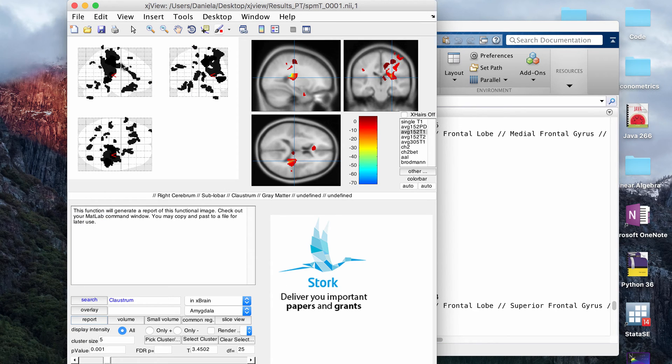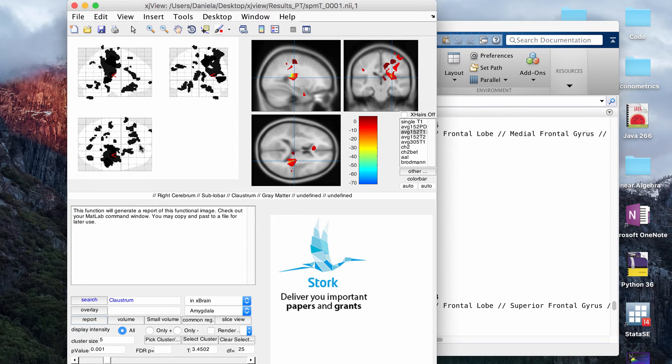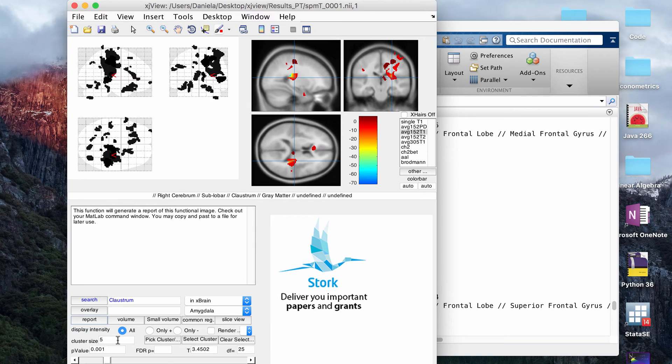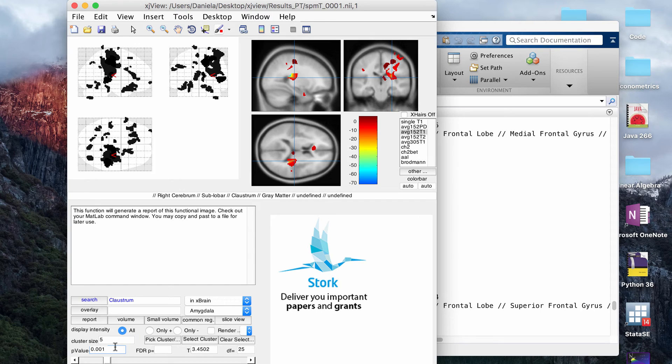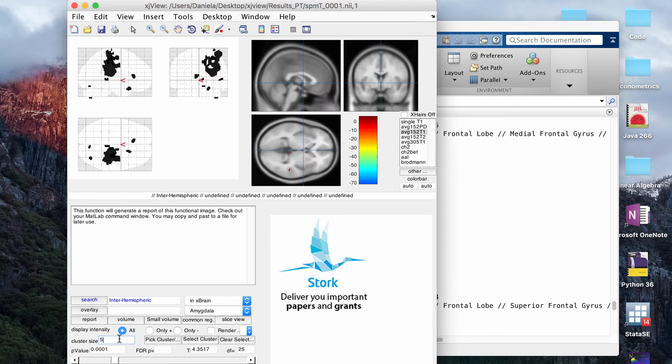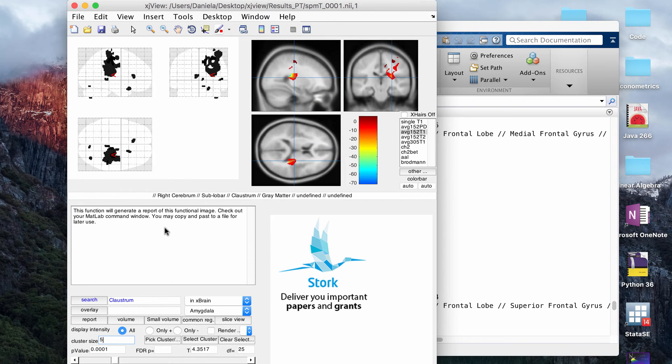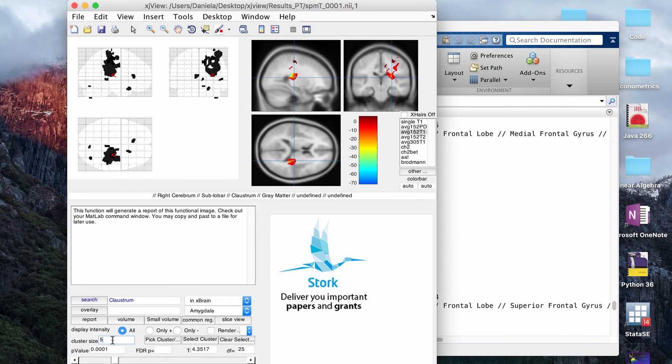Now this is showing up a lot of little clusters, and obviously the main cluster that we care about, I guess, would be the schizencephaly. If you want to change it so not as many clusters show up, you can change the stats before you run VBM, but you can also change it in real time here, certain things. This is recognizing 28 clusters, but what is it considering a cluster? You can change the p-value to make it a little bit more stringent to consider it an abnormal voxel. If we do that, I added another zero, so that removed some of the clusters now. The schizencephaly is still there, obviously.